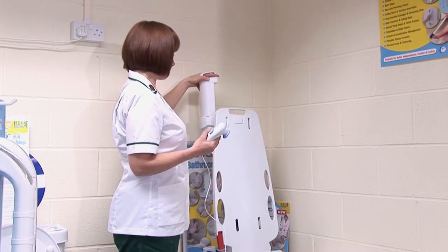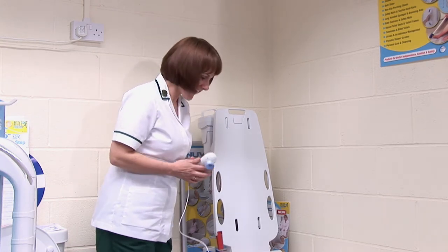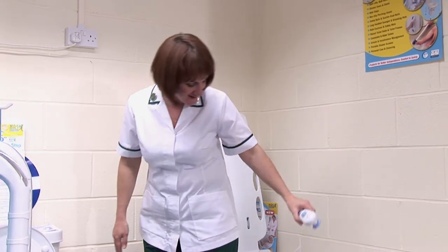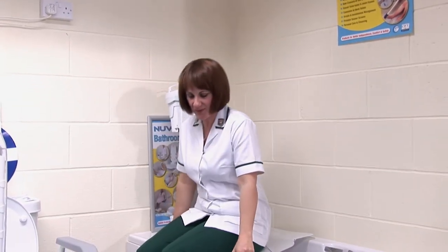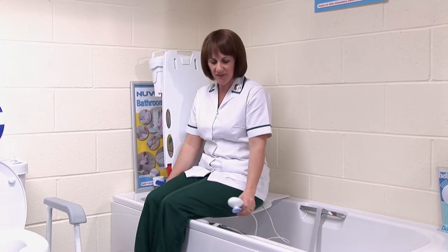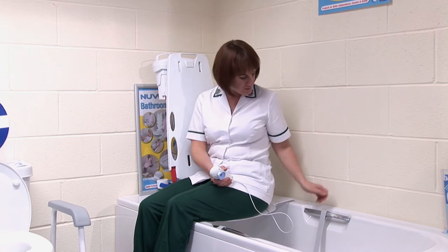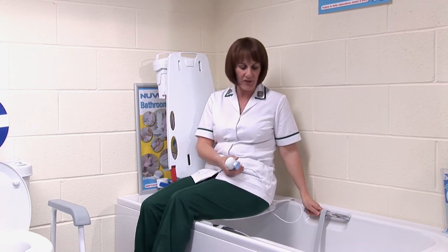Well, the battery certainly seems very accessible, no messing about with it. Give us a demonstration — show us just how easy it is to use. So if you're having problems getting in and out of the bath, we generally advise people to sit at the side like this and shuffle themselves back into the middle of the seat. And then often people will have a grab rail on the side of the bath, or you can use the handles on your bath. Lift your legs over the side like so.